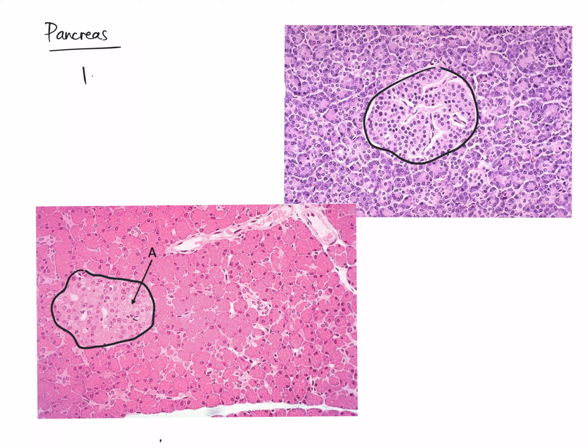We need to be able to immunohistochemically detect certain hormones that are produced by these cells individually to see which cells they are specifically. Could you please tell me what these cells collectively do? What's their function? So collectively, like I said, they serve an endocrine purpose. So we're expecting them to produce the main hormones that we need, and those hormones are insulin, glucagon, and somatostatin.